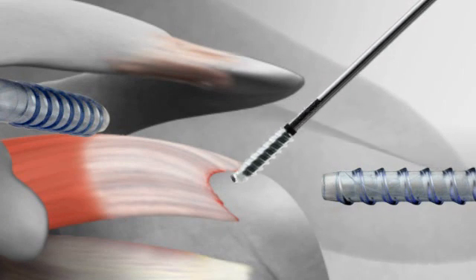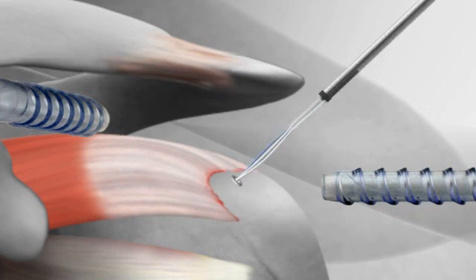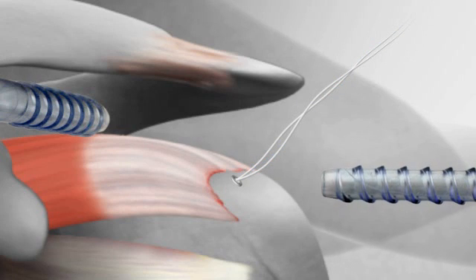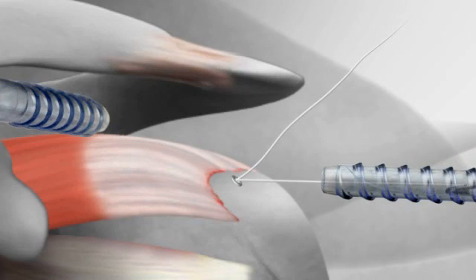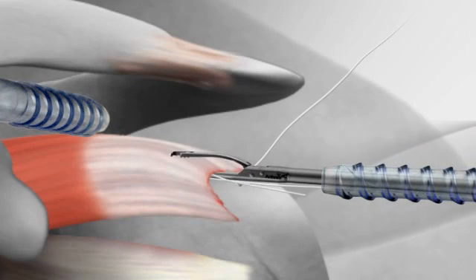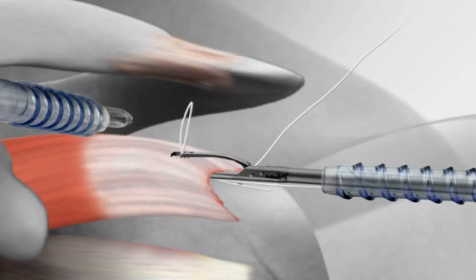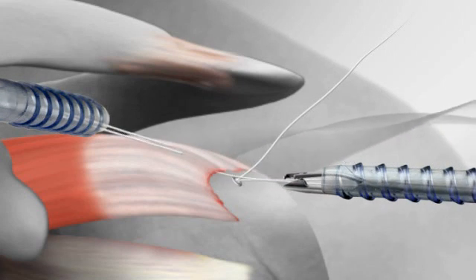A corkscrew FT anchor containing sutures is placed in this socket and the sutures are then passed individually through the rotator cuff from bottom to top. The suture is retrieved and stored in a cannula.